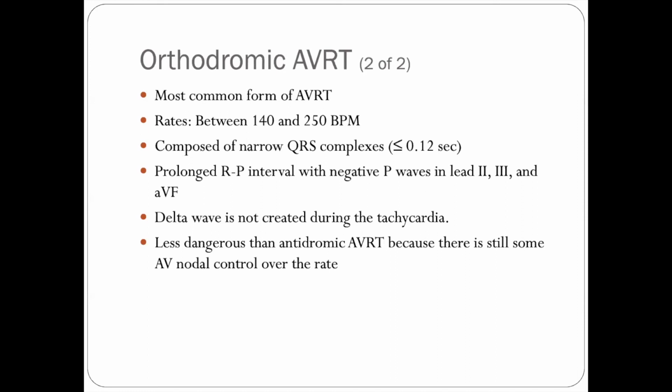So in this case, the atria gets depolarized after the ventricles. Then it hits the AV node. It goes through the entire depolarization of the atria, cell to cell, eventually getting back to the AV node. And then we've got the delay going on. And now it's going slowly through the AV node. It gets through the AV node. Boom, we have the QRS complex.